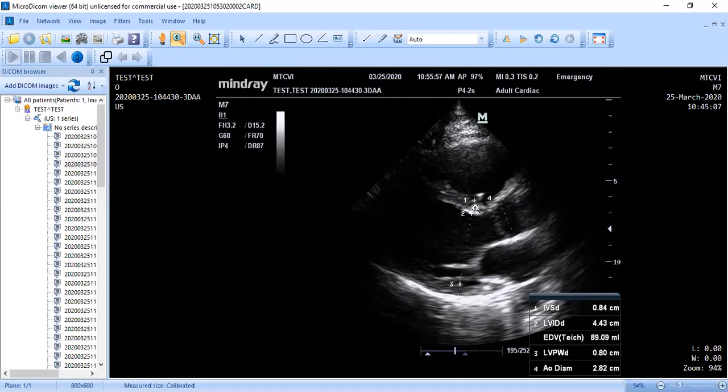So we start there, and we're going to come here right to the bottom line of that interventricular septum. And so you see the plane that we're on right here, we're coming straight down. Okay, now we're going to come from the septum to the very beginning of the posterior or inferolateral wall, which is right here.